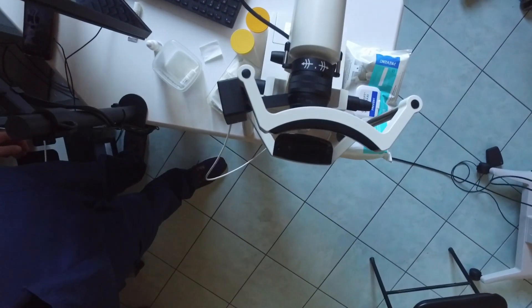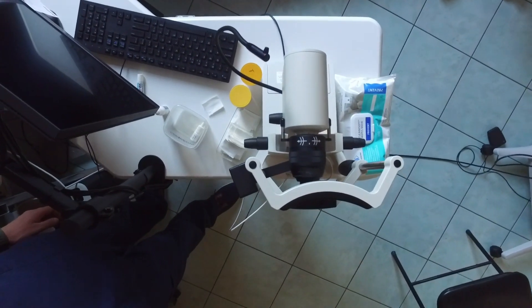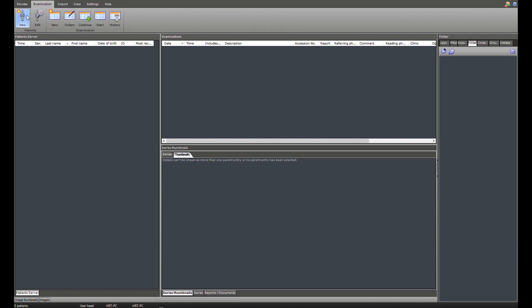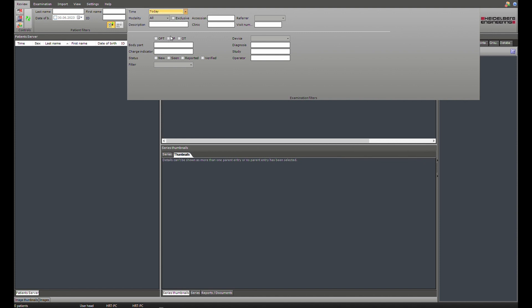Although the HRT3 is small, this whole setup with the computer, keyboard, and machine takes some space. For people familiar with other instruments from Heidelberg, there is the very same HEX software you'll find on other instruments. I always applaud companies for using one software across multiple platforms because it's much easier for users. This is a quite friendly and easy-to-use software. You can add new patients, search for patients based on date of birth, date of exam, type of modality, and so on.